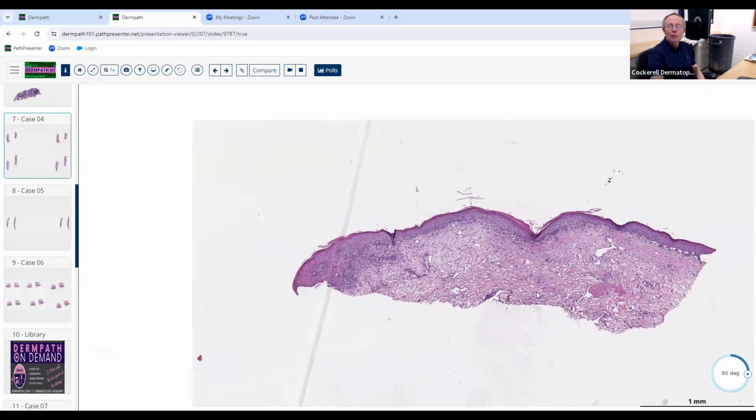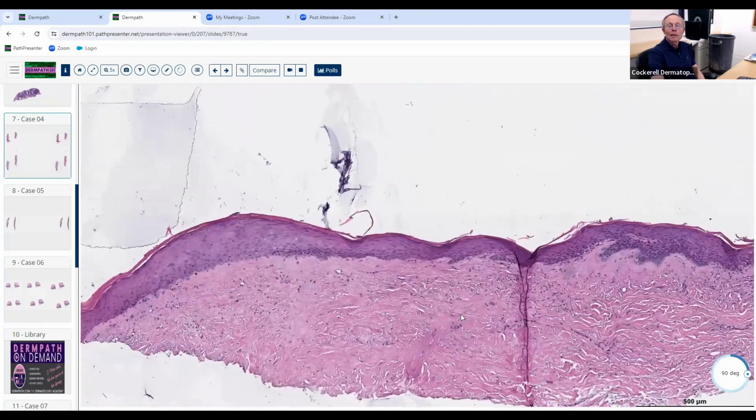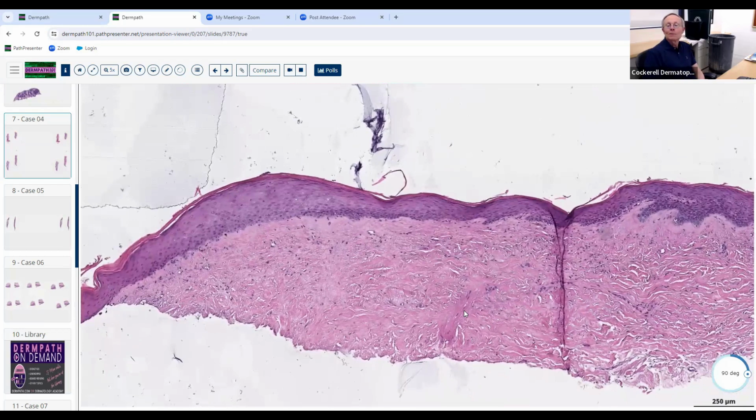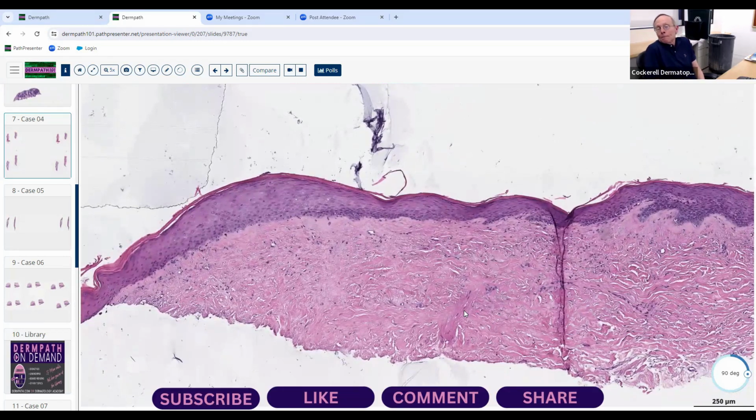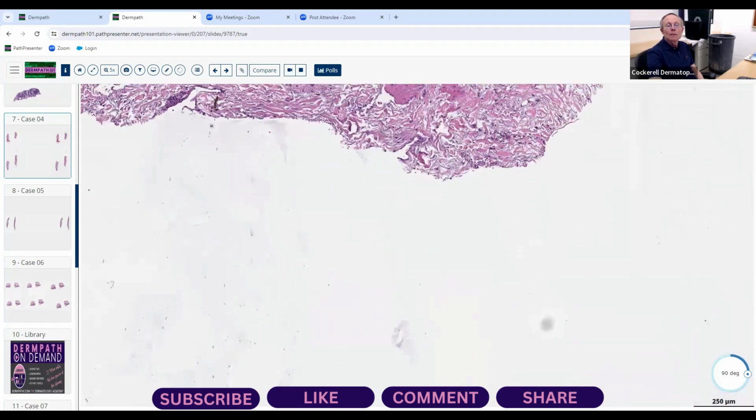So let's say you decide you're going to look at one. So, well, okay, I recognize this as sclerosis, and multiple choice. You look down there and you see morphea, and you just tick it off, and you're happy. Let's go to the next case. I got that one right. Well, if you look at this other piece over here, guess what?